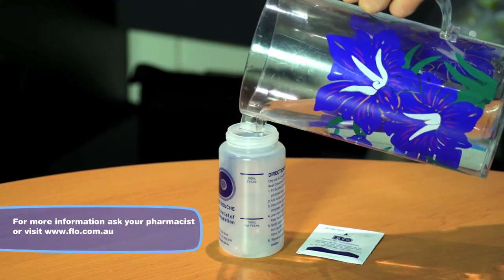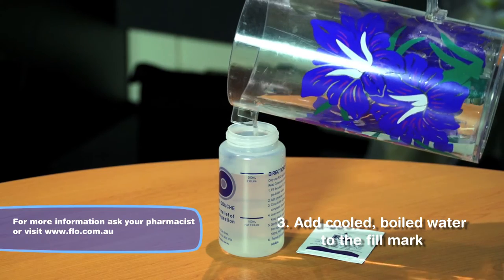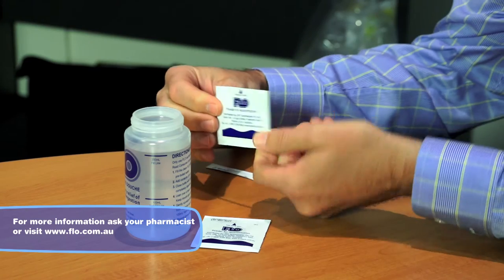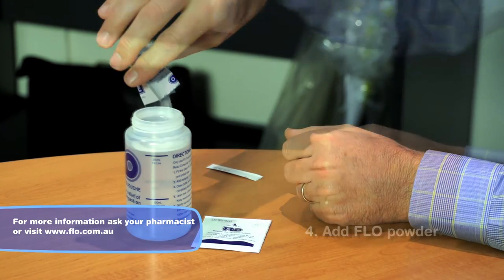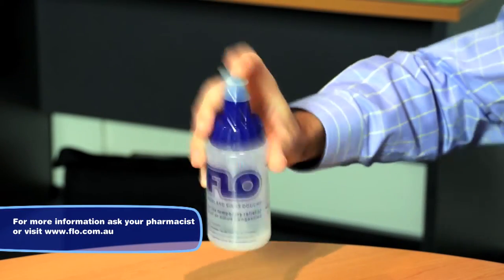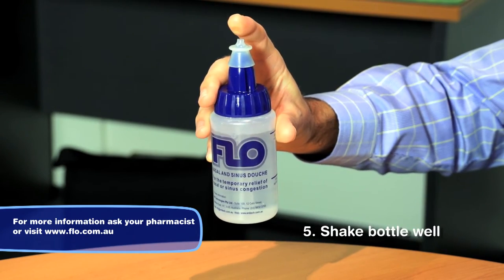Add cool boiled water to the fill mark on the bottle. Cut or tear open one sachet of flow sinus care powder and empty it into the bottle. Screw on the cap and dip tube and, with your finger over the opening in the cap or silicon tip, gently shake the bottle until all of the powder dissolves.